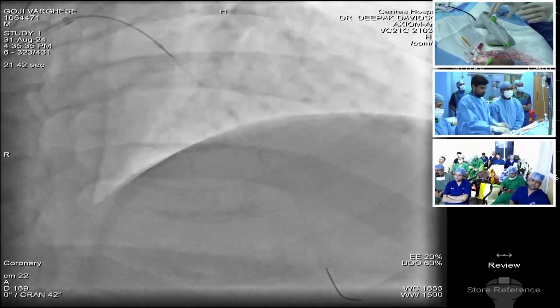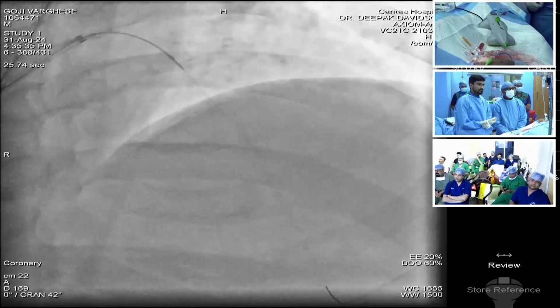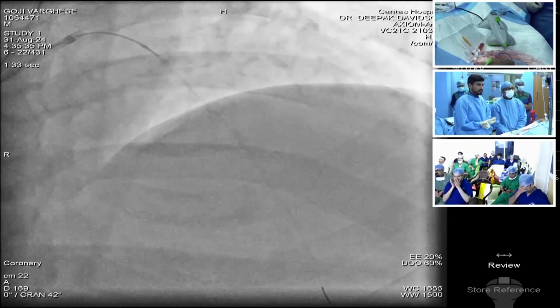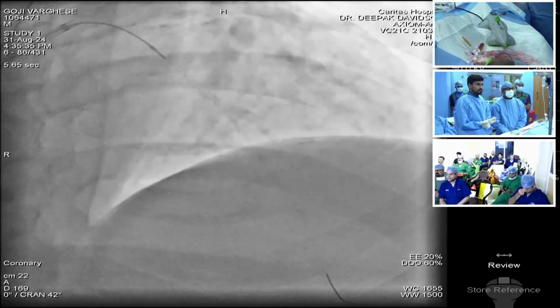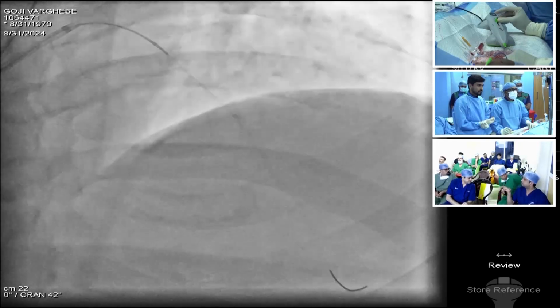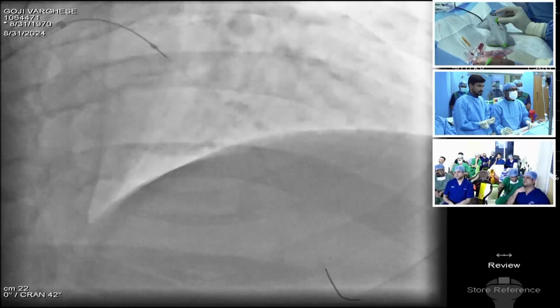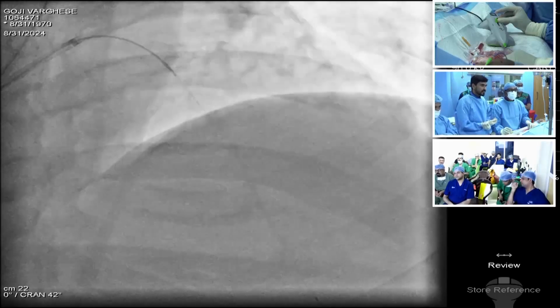We'll wait for 30 seconds. Hemodynamics are good. There is not much change in pitch also.